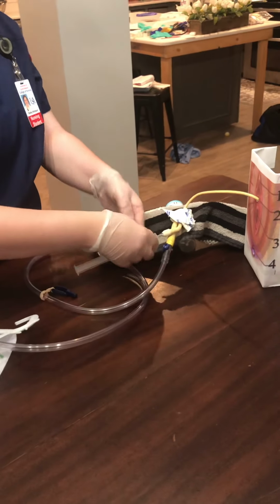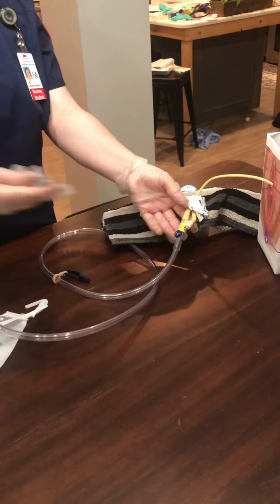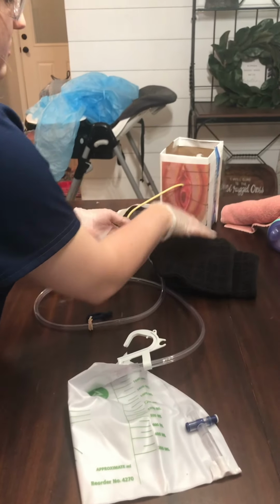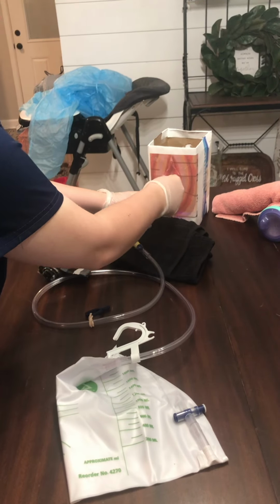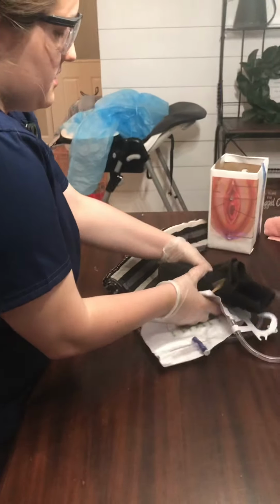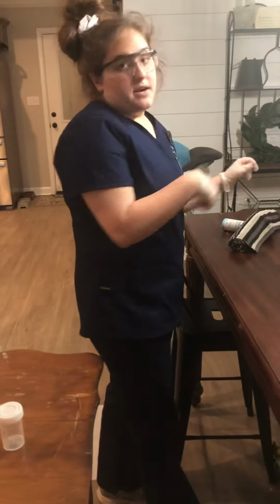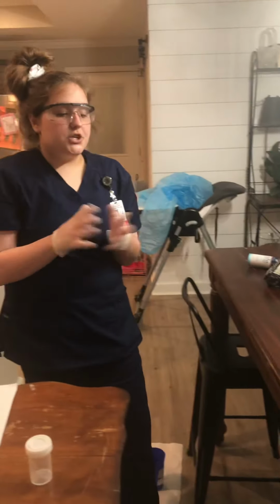All right, so now you're just gonna take this out, discard of this, and then you would get a towel. I would have put a towel down before that. So, and then you're just gonna want to take it out, wrap it in your towel, and discard of all of this. And then I'll throw that away, and then you're gonna want to perform perineal care on your patients after that, as I explained in the beginning, and then you're gonna document.